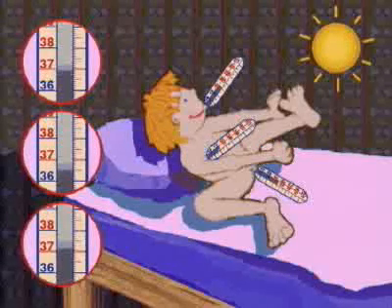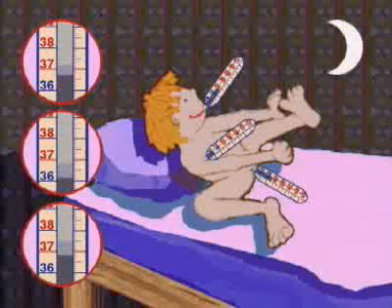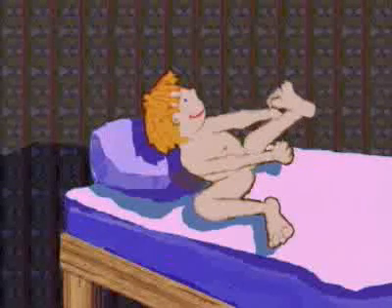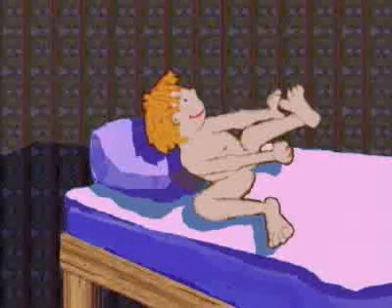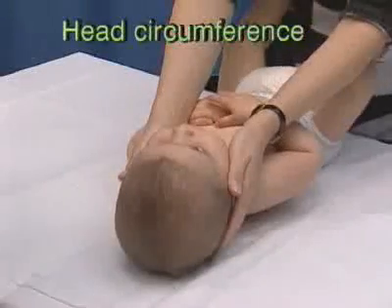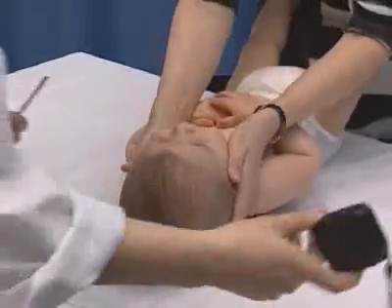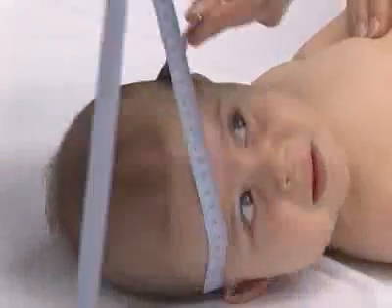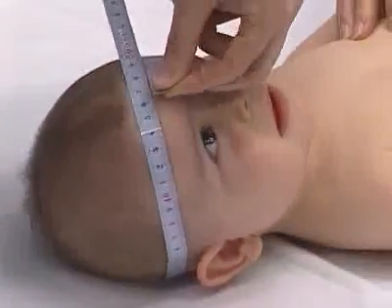Body temperature undergoes rhythmic oscillations during the day. Physical activity and digestion raise the temperature slightly. When measuring the head, take the widest occipito-frontal circumference.